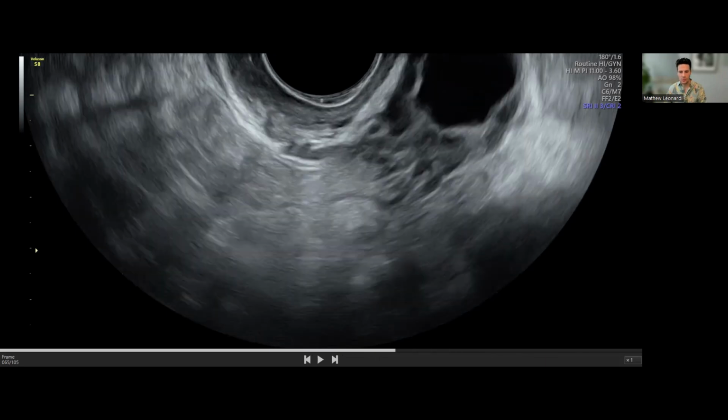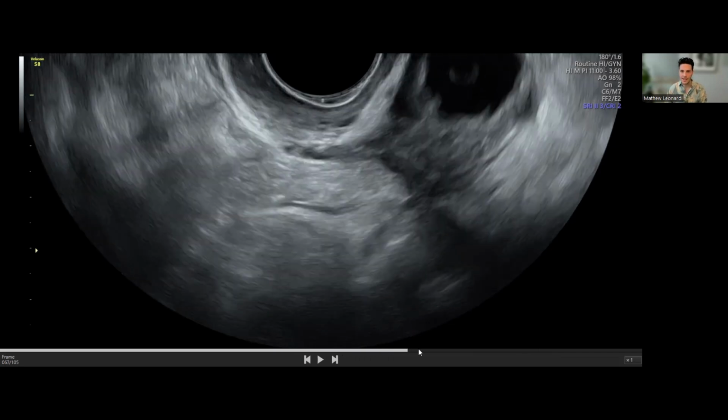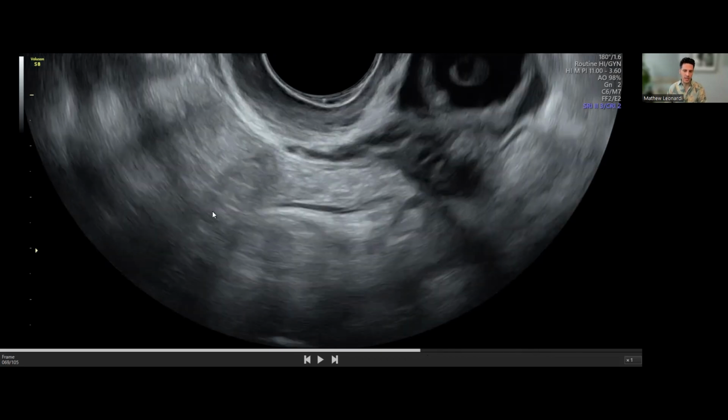I'm starting to get really less worried about there being an isolated bowel nodule, as bowel endometriosis is most often in the rectum at around 8 to 12 centimeters from the anal verge. And at this point, we're actually quite high. We're probably at the level of the rectosigmoid junction at around 15 centimeters. And so way less likely for there to be an isolated lesion here.